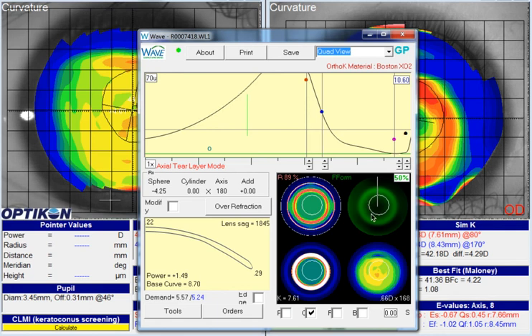So with that change in the vertical meridian, we're about 15 microns more shallow. Horizontally, we're about 20 microns more shallow. With the most recent change, that did bump our clearance back up to high 80s, close to 90s. So this lens, I would still expect to see a small bubble there. I don't think it would be a problem.